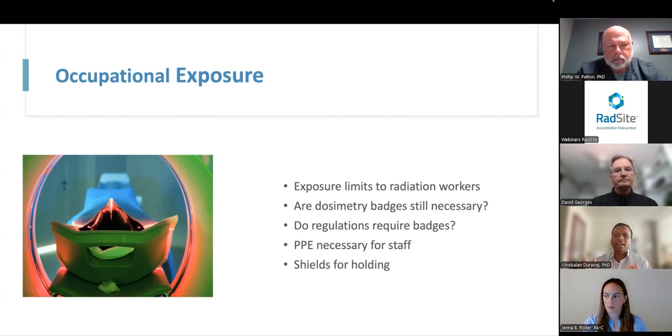Okay. So in that case, I understand that it's pretty much similar to conventional CT rather than anything like fluoroscopy or a cath lab situation. Depending on the room size and the workload, most of the time it will be very similar to conventional CT. I do not know whether holding patients for CBCT scans is that much of an occurrence these days, but if that is the case, from the discussions we just had, I understand it will be exactly the same as conventional CT.